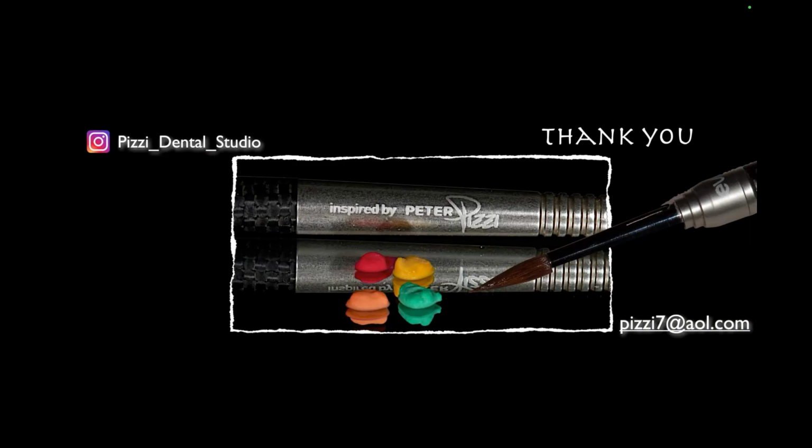Yeah, that piece, believe it or not, is probably at least 10, 12 years old. She was a very young girl who was going to her prom, and she really hated her spaces. She had been in ortho for years, and I used to show that case a lot. I haven't shown it in so long, so I don't remember the whole case. But the bottom line is they were four window veneers that I did on refractory materials back then. And boy, was that challenging to devest those and keep that material together. And I was more concerned when the doctor had to slide those in the mouth. So, yeah, 0.2 of a millimeter, if that.